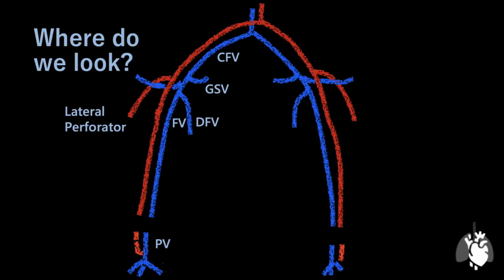Let's start with a simplified vascular anatomy that focuses on the deep system and arterial landmarks. At the bottom, behind the knee, we have the popliteal trifurcation and the ascending popliteal vein. In the distal medial thigh, the femoral vein emerges from the adductor canal and runs its way up the thigh until joining the deep femoral vein, and then becomes the common femoral vein at that point.